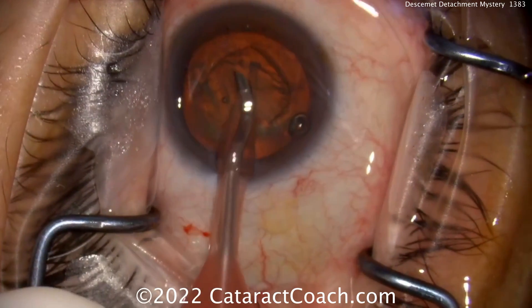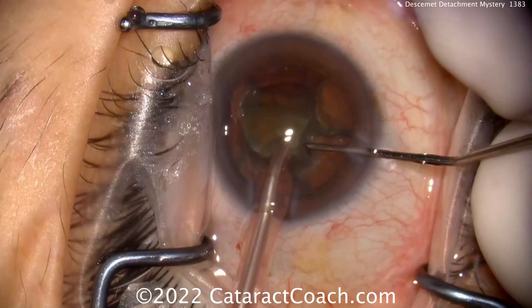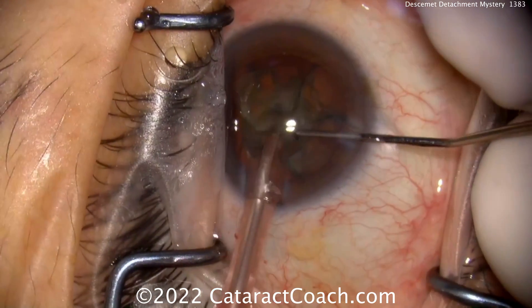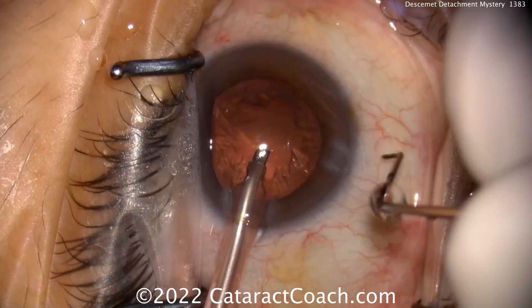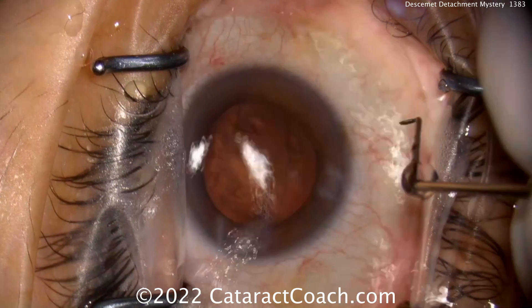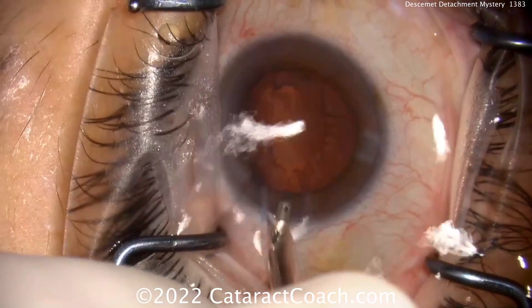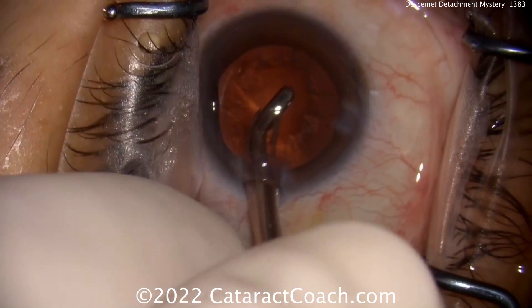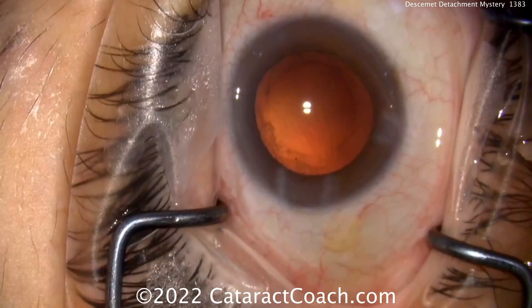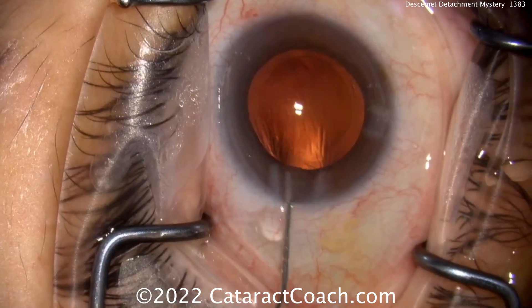At the end of the case we're going to see a Descemet's detachment. The phaco probe is near the end of the eye very cautiously, which I liked. Now the nuclear pieces are removed — the phaco probe is a little close to the incision, and the infusion could help dissect off Descemet's. There you see already there's a slight Descemet's detachment — that's the first sign. The incision outline looks pretty good where hydration of the stroma happened, with good tunnel length and position.